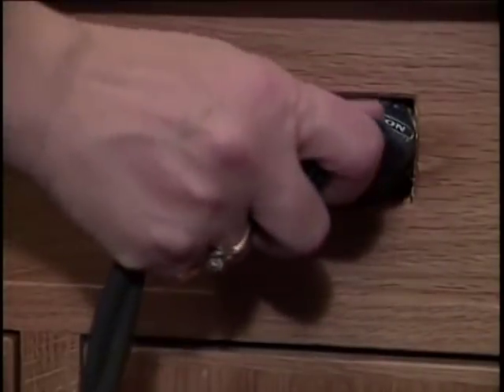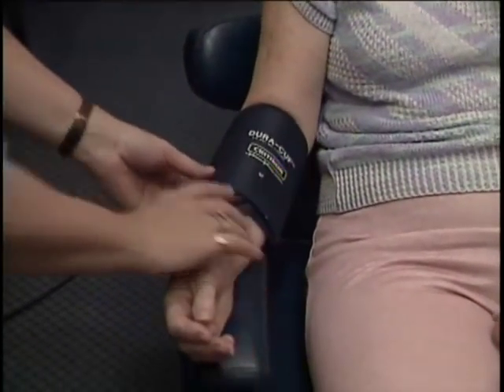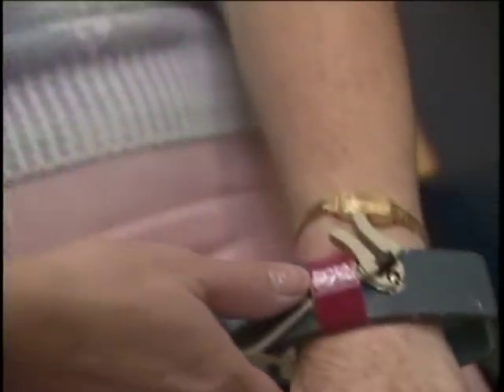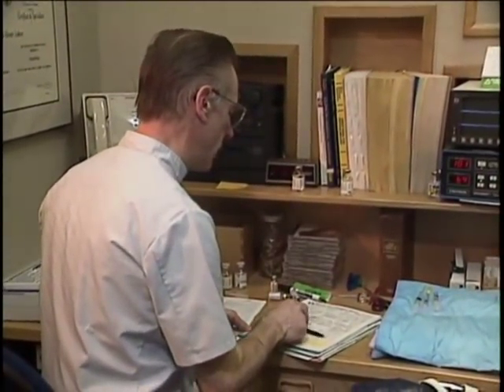It's the left eye that we're doing today. Prior to the anesthesia, upper eyelid margin levels are recorded for comparison postoperatively, and vital signs are checked. Automated blood pressure measurements are taken on the forearm. Pertinent medical and ophthalmologic data are extracted from the chart, including the axial length of the eye to be blocked.